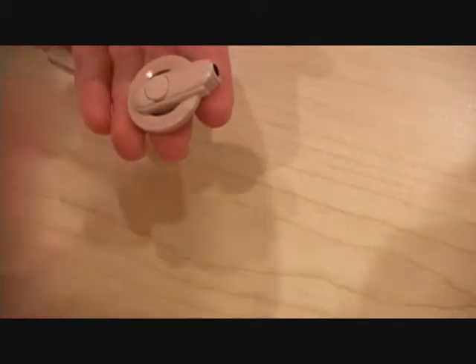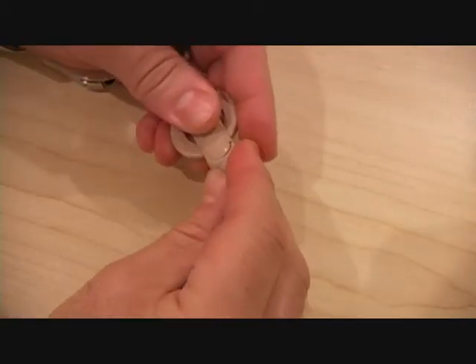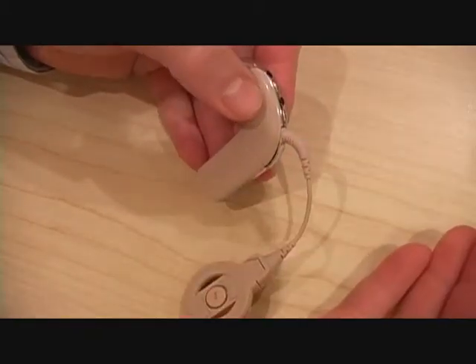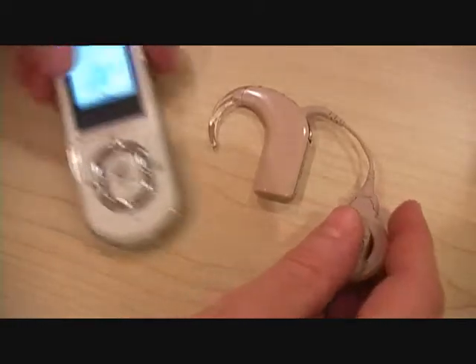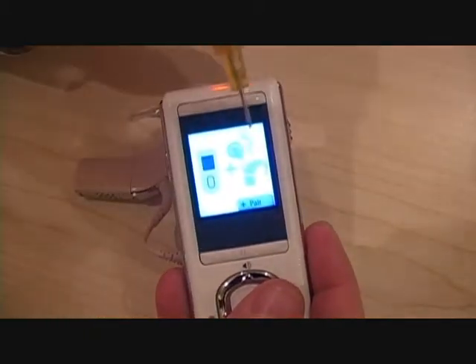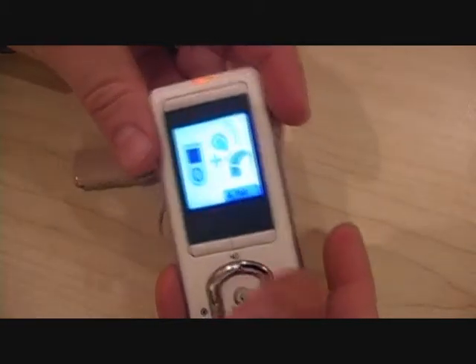Take the spare cable and insert it into the coil and the processor with the cable facing the bottom of the processor. Now put the coil over the back of the remote to see if you get the green communication lines. If you do not see the green communication lines, next replace your coil with a spare.